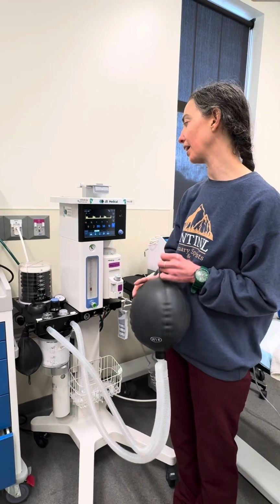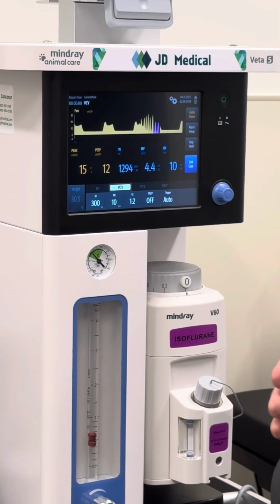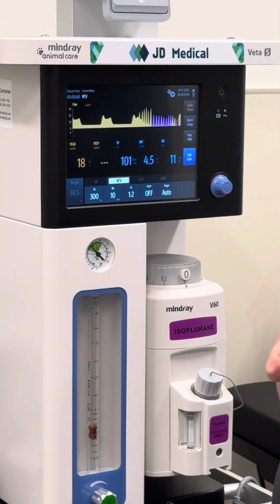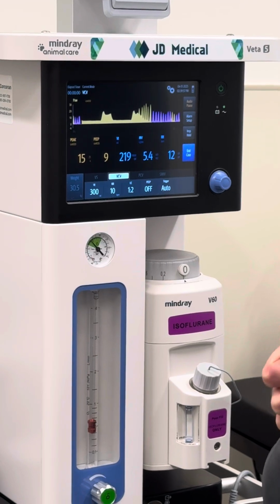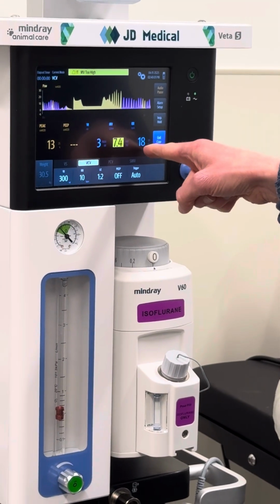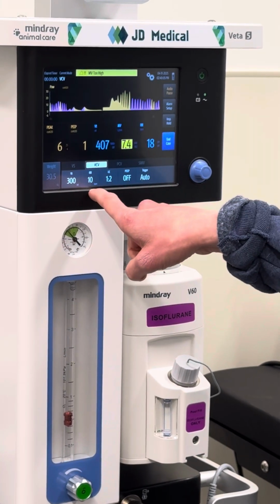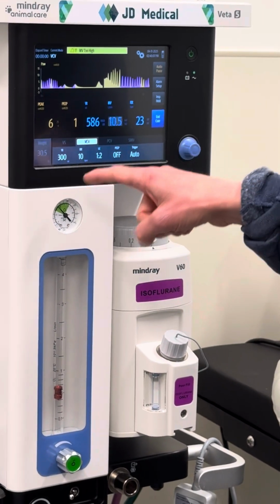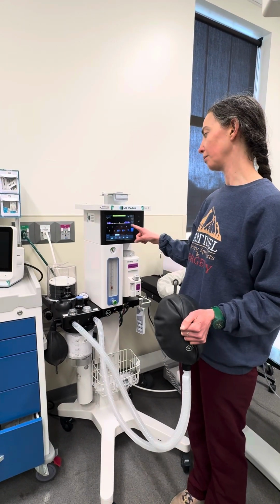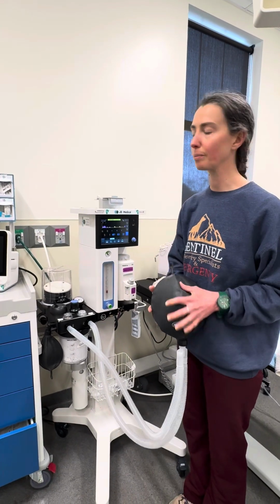So if the patient's bucking the ventilator, you might notice that that rate changes. Let's see if I can change it. So now it's going to go up and the ventilator's going to get mad at me, but these are the fun things we do, right? So now it's like, okay, your respiratory rate's going to 18, but you're asking me to give 10. And so when you see a discrepancy like that, you know probably your patient's bucking the ventilator because the machine's telling you there's way more breaths happening than what the machine's being asked to deliver.